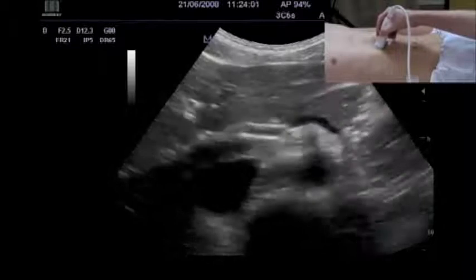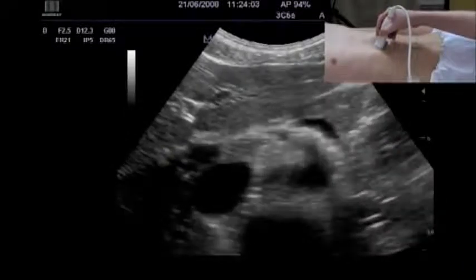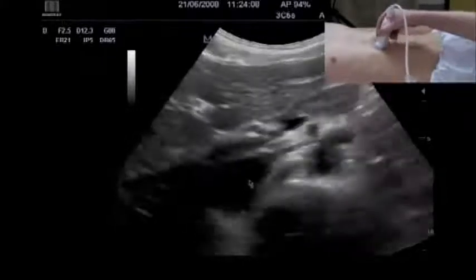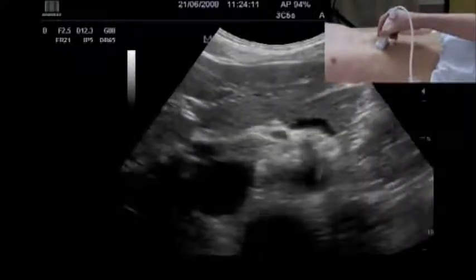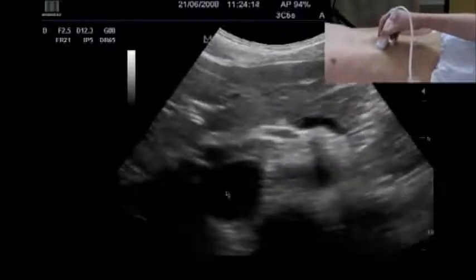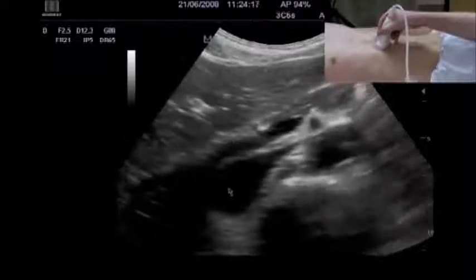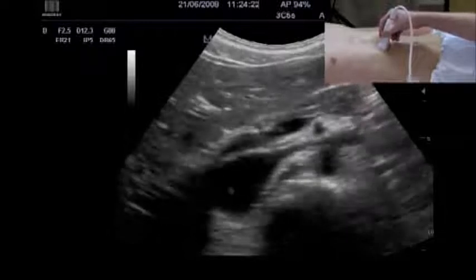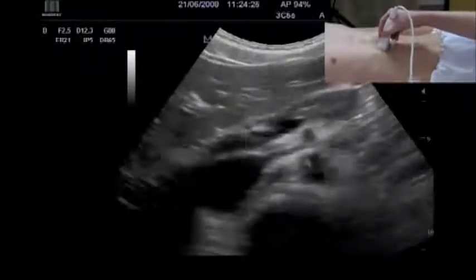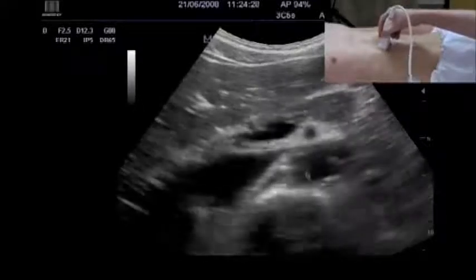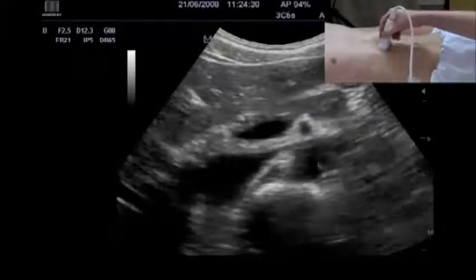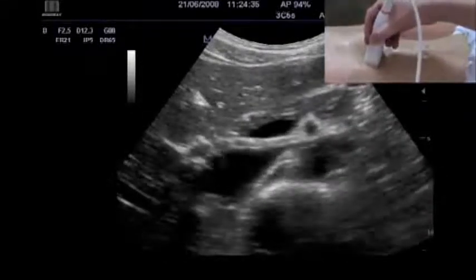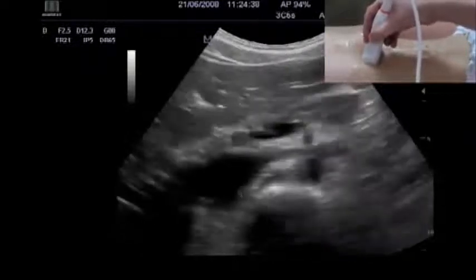What do we recognize from dorsally? Here is the spine. Then we see the aorta, and to the right the inferior cava vein. The aorta, being an artery in cross section, is round, whereas the inferior cava vein, being a vein, is more flattened. The content of the cava is darker compared to the aorta because of the arterial flow — the pulsations give rise to some echoes, whereas in the vein there is a more steady flow.